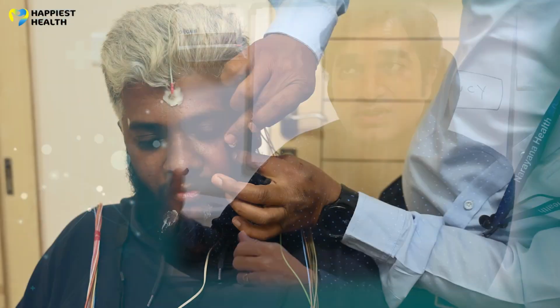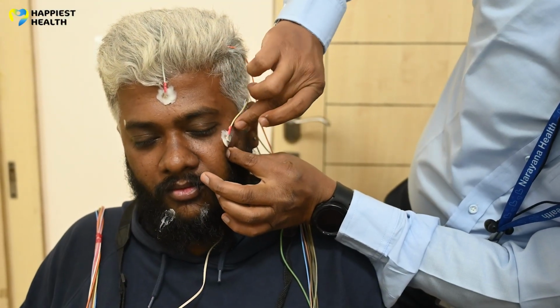That would be, for example, very relevant to those who have insomnia. The second group of disorders which I told you about is sleep disordered breathing. If we go one step more into parasomnias, I may want to understand the architecture of sleep. I may want to understand if there are any breathing problems, and whether there are any unusual movements with the right leg, for example. So we may have some extra electrodes in the leg, or around the eyes, or in the limbs, which will tell us all these things.